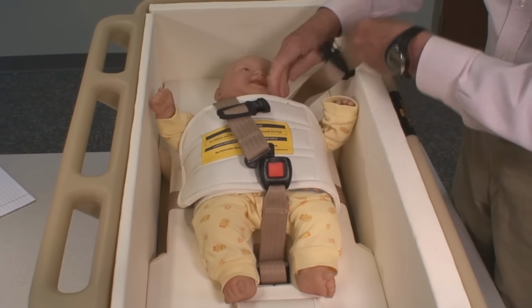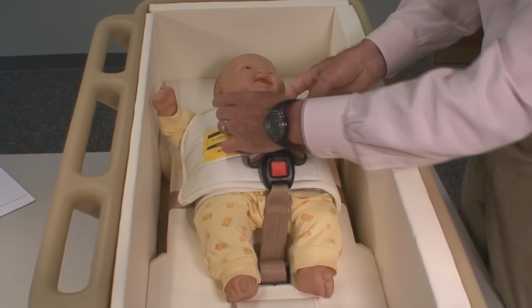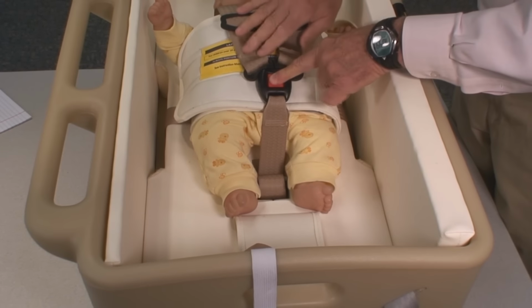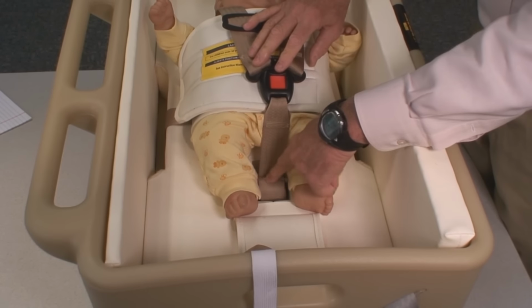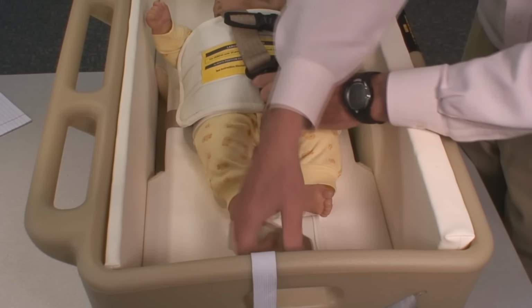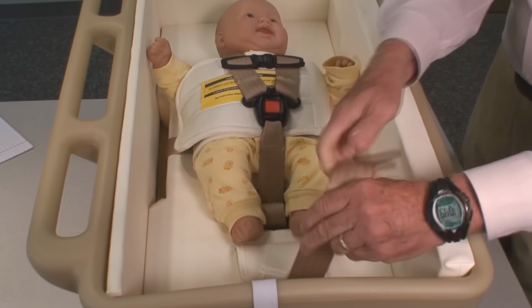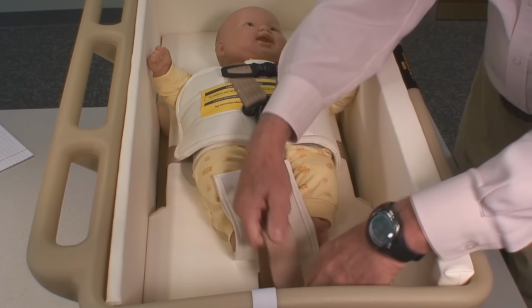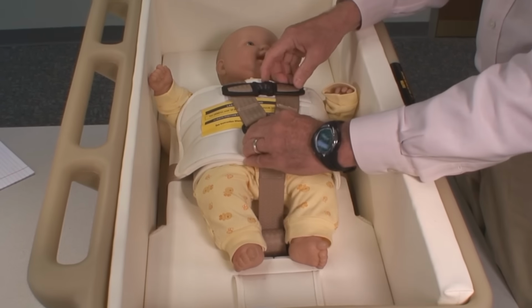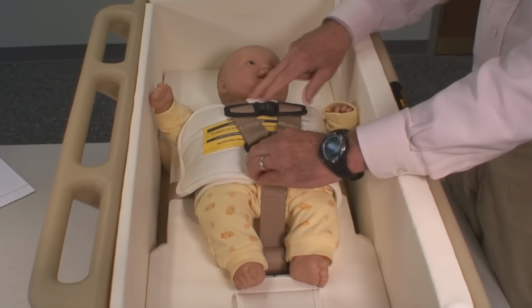Insert the latches into the buckle. Insert the harness clip, making sure that the buckle's where you want it positioned. That adjustment can be changed by this adjuster here, but this looks fine. So we're going to pull the A-lock strap tight, which tightens the shoulder straps. Tuck it away with the flat back. Make sure that the harness clip is adjusted to armpit level and the shoulder straps are nice and tight.